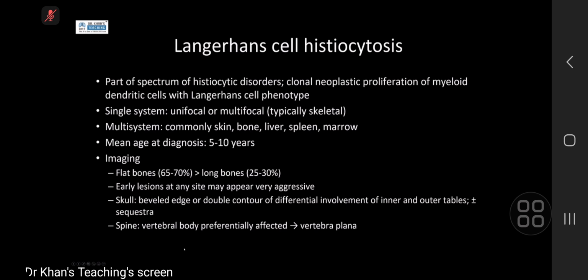Lovely description. I think those are quite tricky on the MR, to be given the MR to start with. It is part of a spectrum of histiocytic disorders.